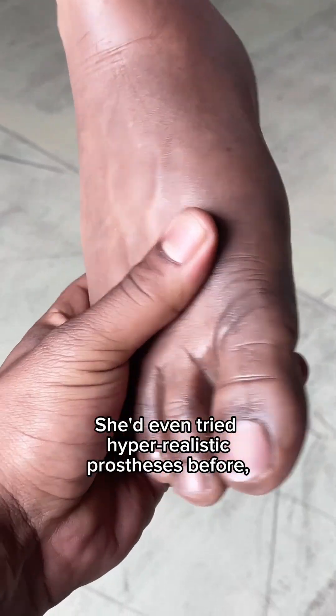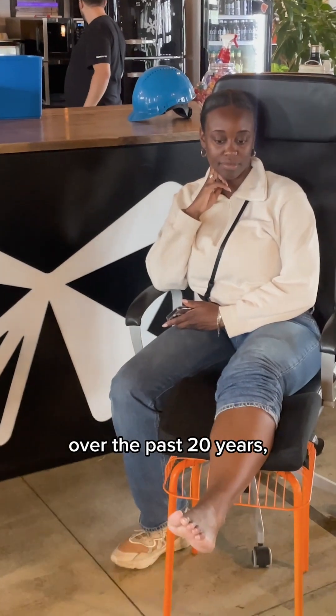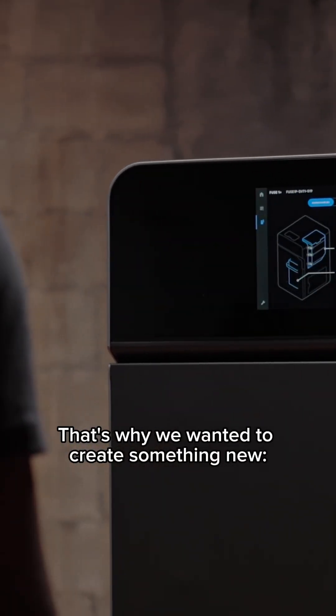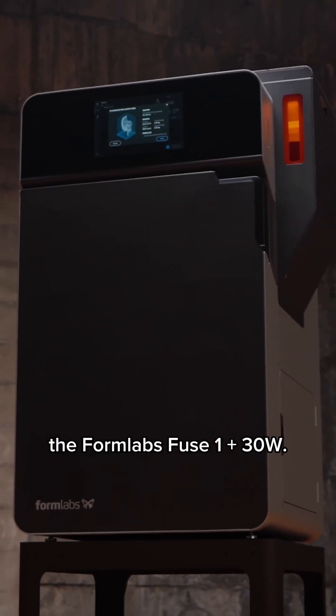Sydney lost her forefoot due to cancer. She'd even tried hyper-realistic prostheses before, but she's hardly worn any of them over the past 20 years since they are always uncomfortable. This is why we wanted to create something new: a comfortable, functional prosthesis manufactured with an industrial SLS 3D printer, the Formlabs Fuse One Plus 30 watts.